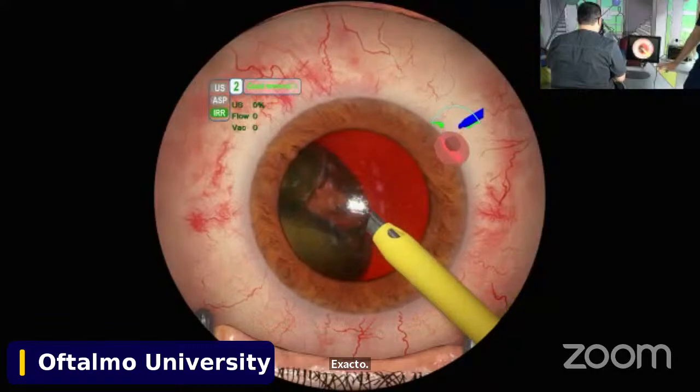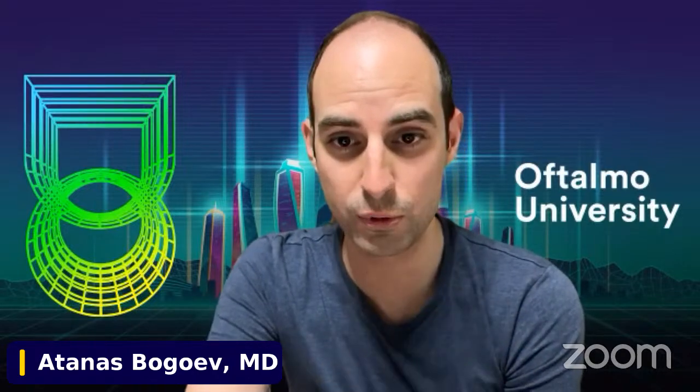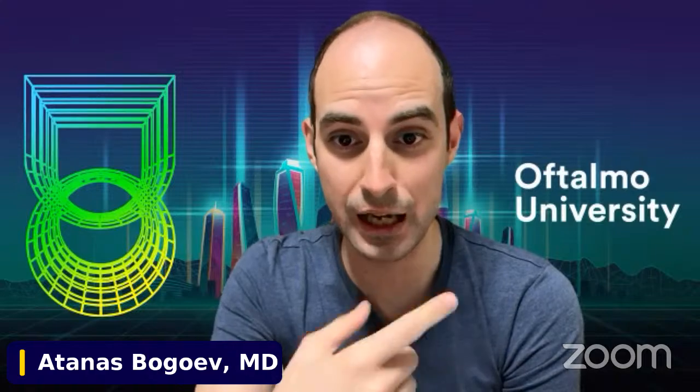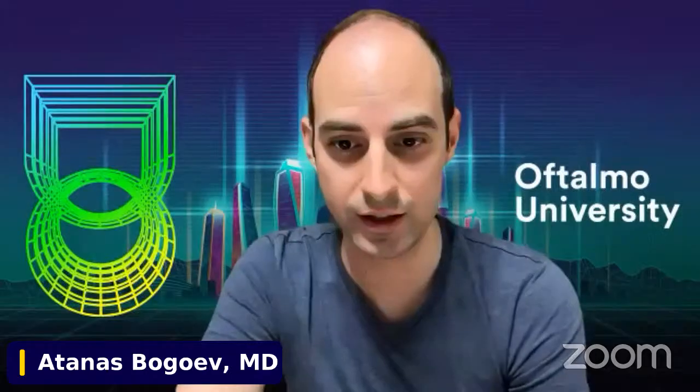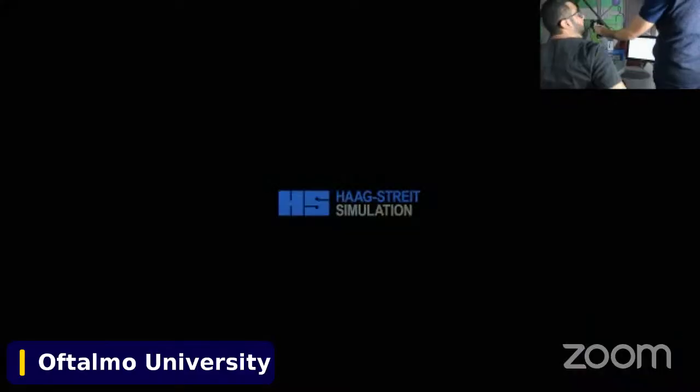So if you notice in the bottom, those green things that you see, these are actually feedback from the machine. So you're getting them live. If you're rupturing the zonula, it says, careful, you're putting too much stress on the zonula. So you get this live feed. But then again, you can stop at the end of the case, you can go back and pinpoint each and every time it happened. Exactly. And you can also have audio feedback from the machine. You have visual feedback and audio feedback telling you what you are doing wrong, live.